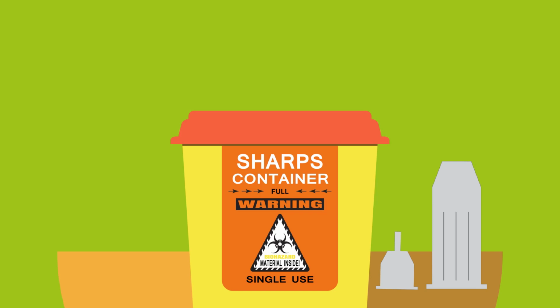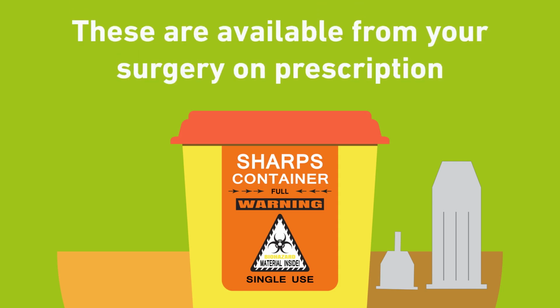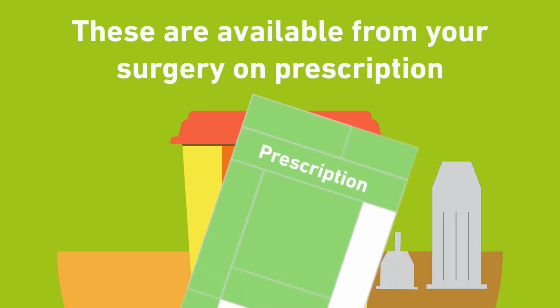It is recommended that you always use a yellow sharps box for the disposal of pen needles. These are available from your surgery on prescription.